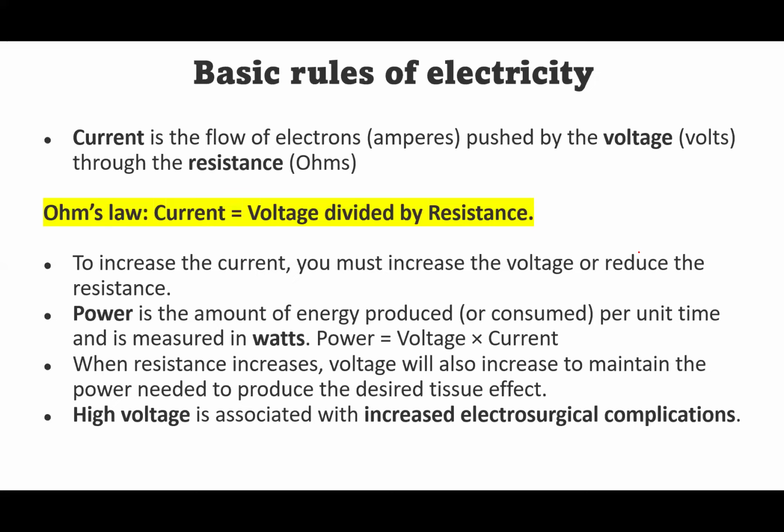So power is equal to voltage times current. If you deliver high voltage and high current, high watts or power of electricity will be consumed by that resistance.